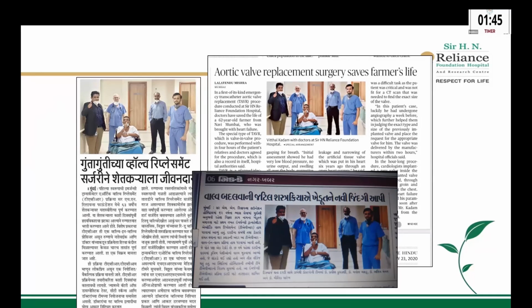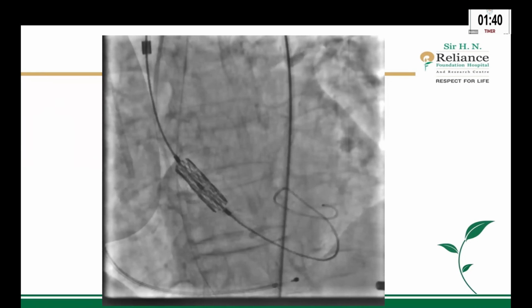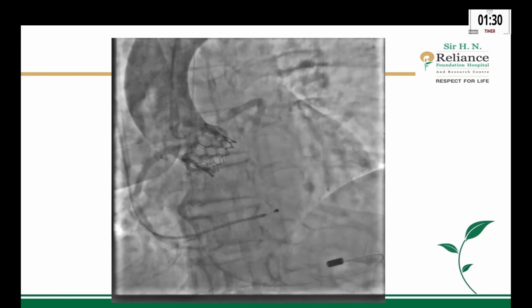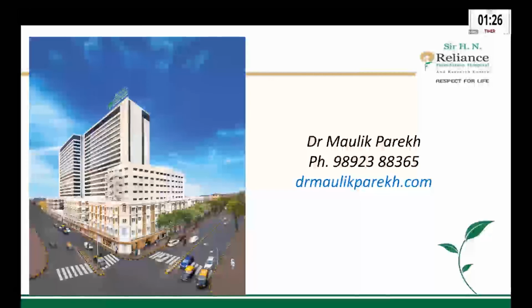Somebody has told me that they wanted to see a MyVal case. I have 2 minutes left still. So this is a MyVal, an Indian valve. And this is the result. I will just go through the result part. It's a balloon expandable valve. Thank you very much.